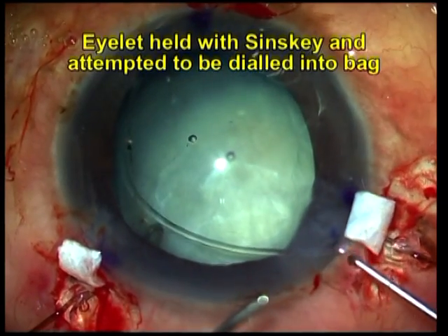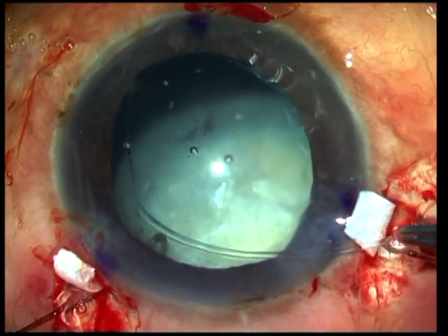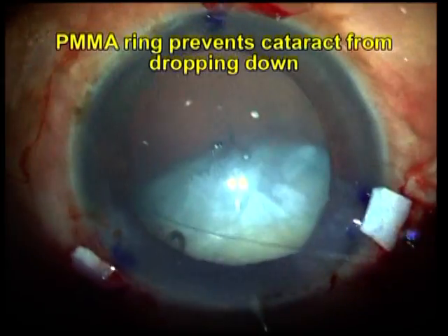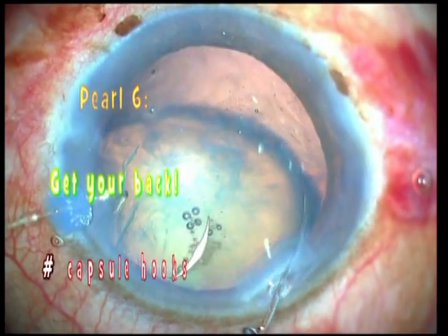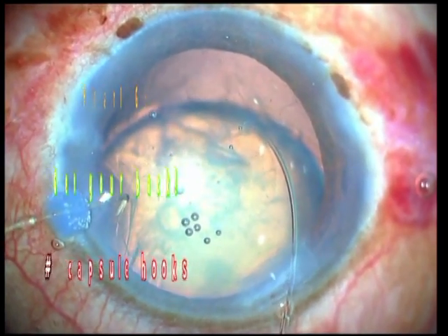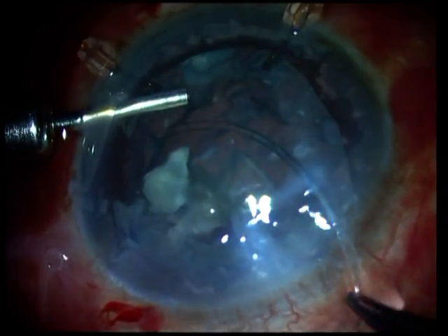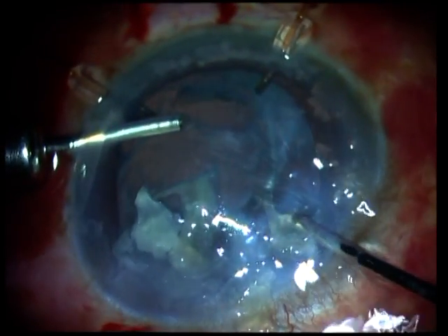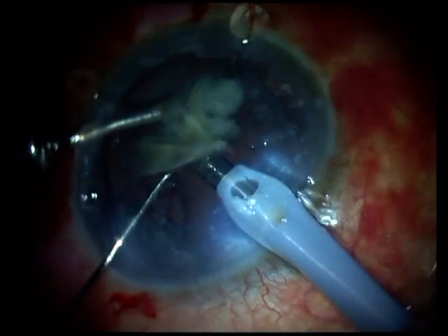Here's another case where you can see that the very act of attempting to implant the capsular tension ring into the bag results in loss of the final few zonules which were holding the subluxated cataract in place. You can also see the same thing repeating in this case where the subluxation just dramatically increases. That's my pearl number 6: make sure you're holding the capsular bag supported with capsular hooks, which makes it much more easy to implant the capsular tension ring into the bag even in large subluxations without extending the area of zonulodialysis.